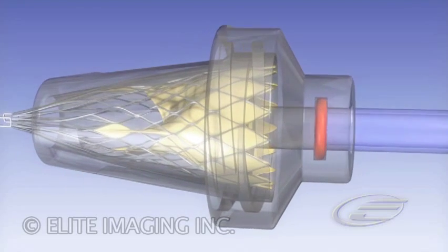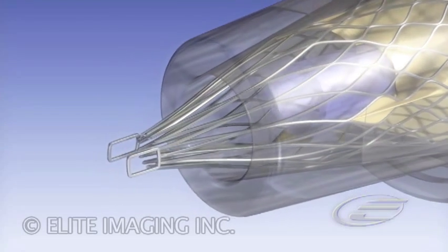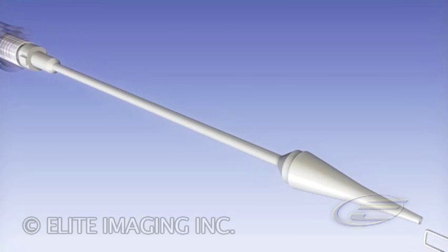Insert the inflow tube non-tapered. Continue to advance the inflow tube until the frame expands. Insert the catheter tip, distal end, through the outflow aspect.